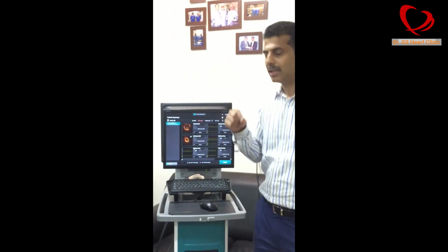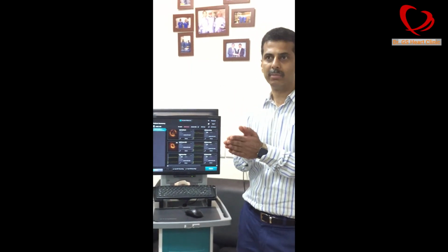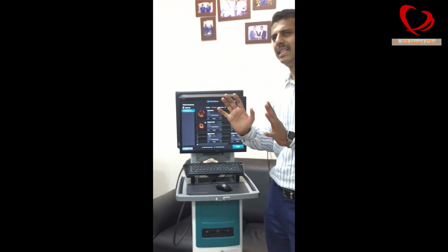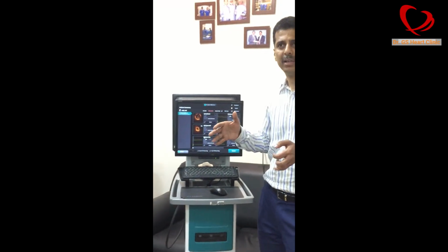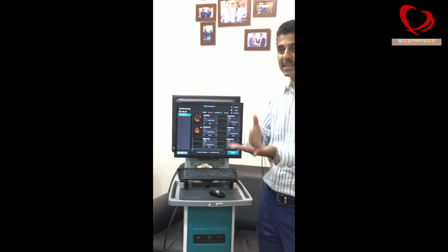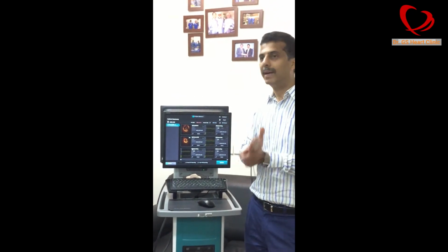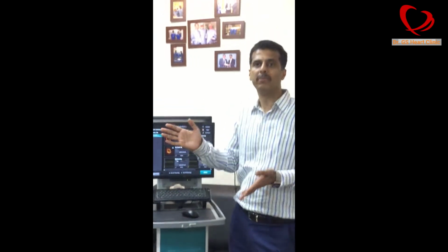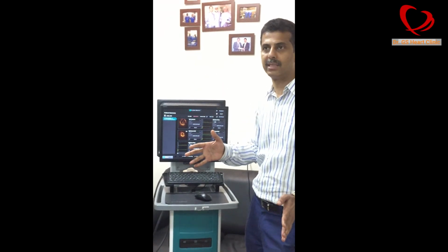It's the beginning of the vessel, and OCT shows a very tight area of 1.82 square millimeters. Considering that generally anything less than 2.7 is significant. But if you do an FFR, it's a matter of another 5 minutes. And then we have 100% evidence that he definitely requires a stent. By chance, if the FFR is above 0.8, then we have to come out without doing anything, because we have to believe the FFR. That is the most important test.